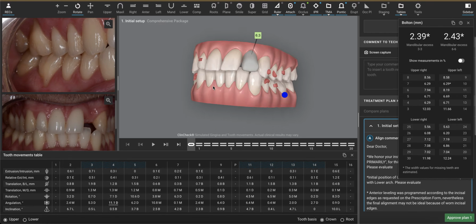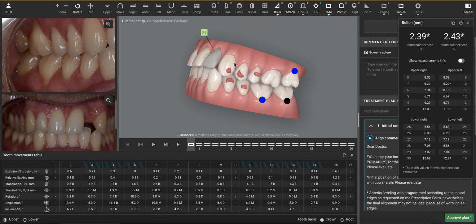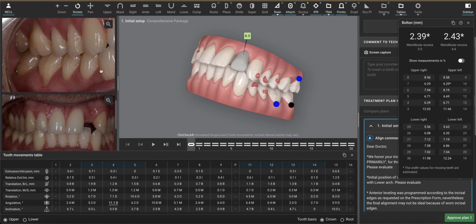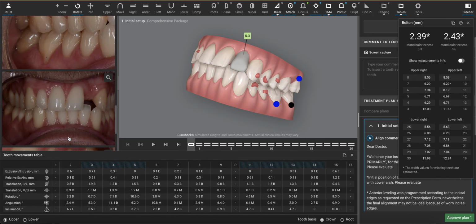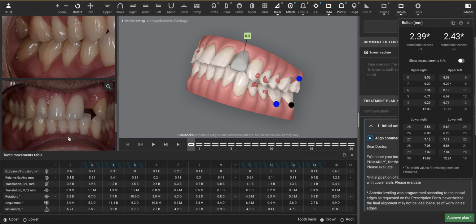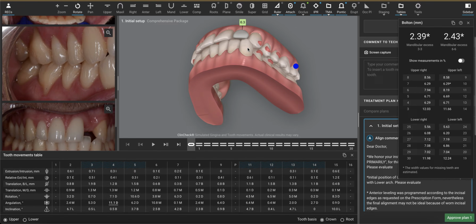The patient does have, let's see, this crossbite of the canine could be the reason that we have posterior issues. As a matter of fact, I'm wondering if the photos I'm looking at, yeah, this might be 14 and 19, and I wouldn't be surprised if that was the case. The lack of proper coupling of the canines on that side increased the chance of posterior tooth issues due to lack of canine guidance.